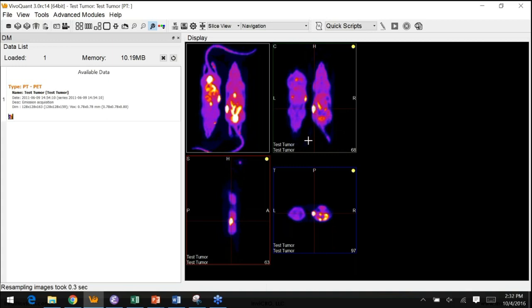And so a common internal workflow is actually to separate out these. Obviously, because they come from the same imaging file, they share a lot of the same meta information, but there's obviously distinct aspects to them. So a lot of our workflows, together with the IPACs, involve separating them and treating them as independent images from a starting point, and then continuing on to do your quantification. So we have some nice tools for that here.